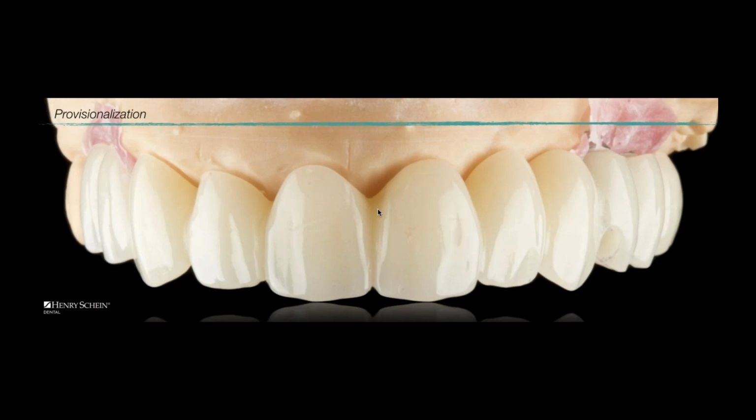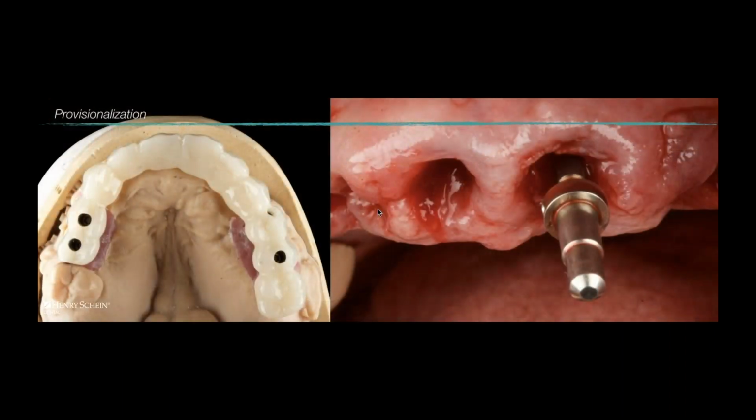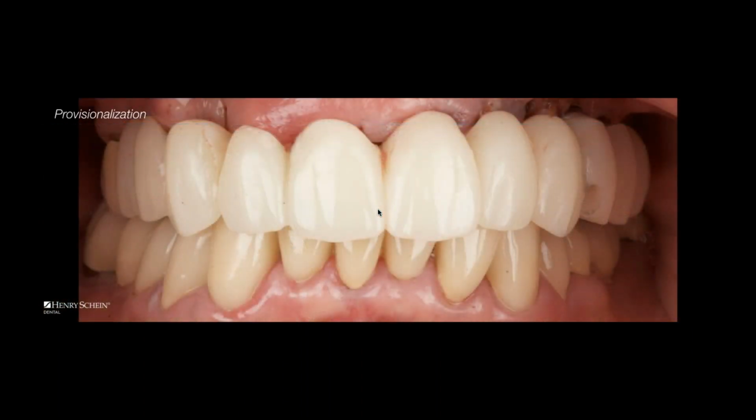Now this is going to be an All-on-4 type prosthesis where we place maybe one or two more implants. We have existing implants. We do not need bone reduction, so we create here a tooth-only prosthesis, a white-only prosthesis, like a crown and bridge style restoration with abutments and pontics. We go to the day of surgery, we're going to be able to take out the teeth, and based off our CBCT and the surgical guide, place the implants very accurately, and then provisionalize the patient all in one day.